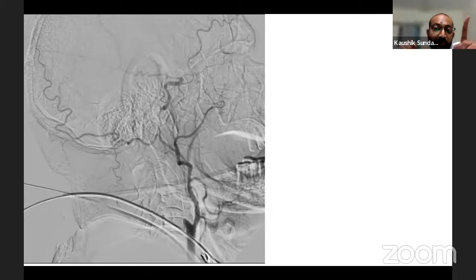And then without curving your microwire, sometimes you might even use a coronary wire, slightly stiffer wires, to cross the lesion. A very small microwire like a Hybrid will never cross. You getting what I'm saying? Yes. So you need a slightly stiffer wire to cross that lesion. So you crossed it, you did a balloon angioplasty, fantastic decision.